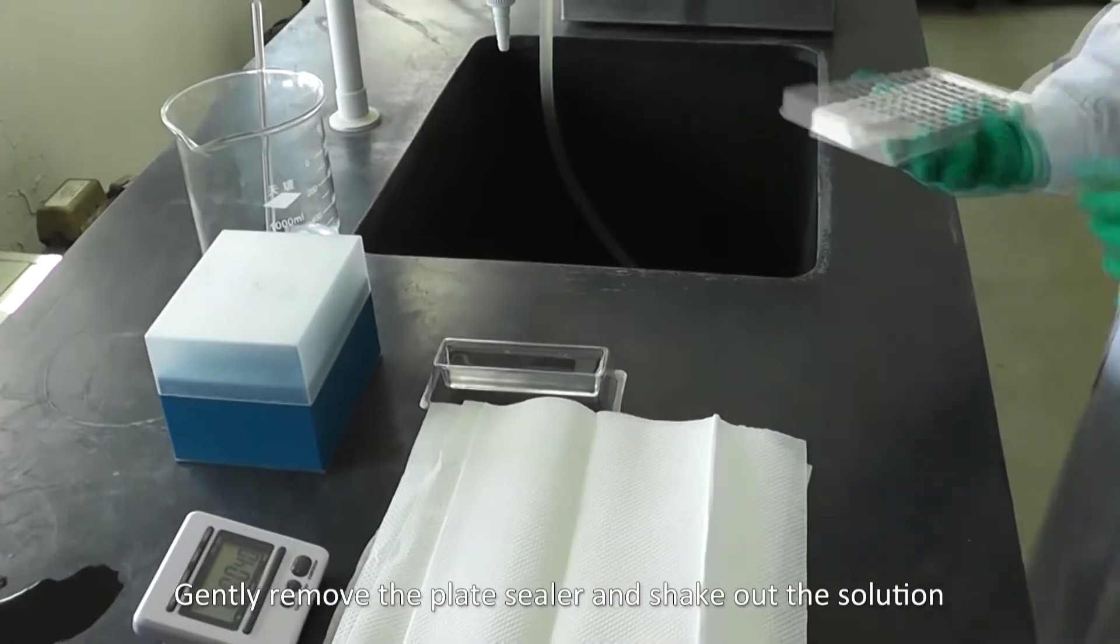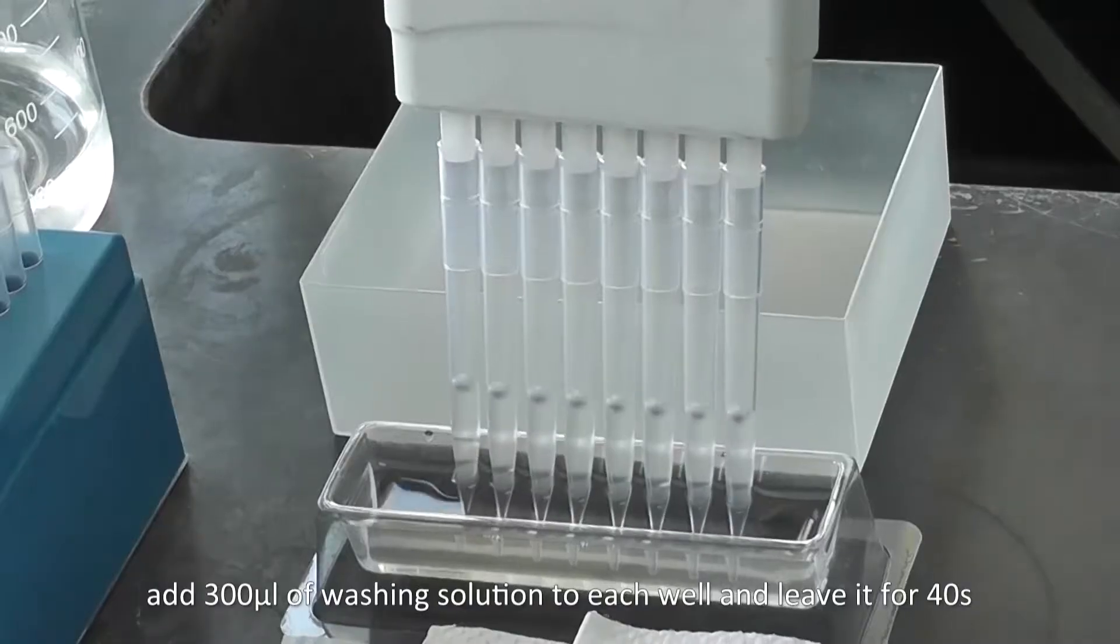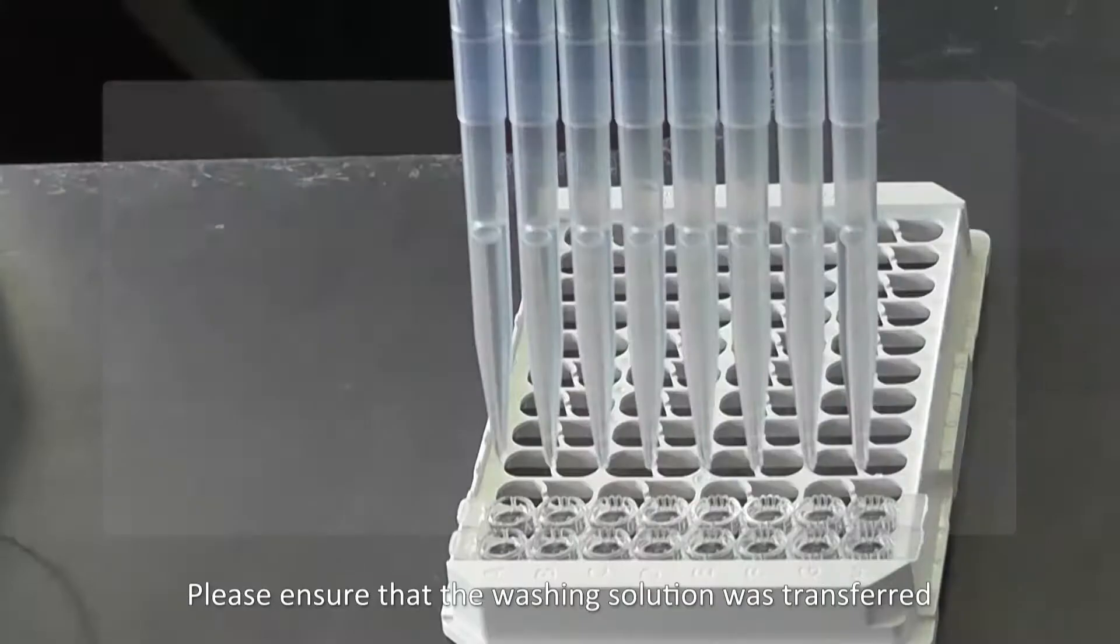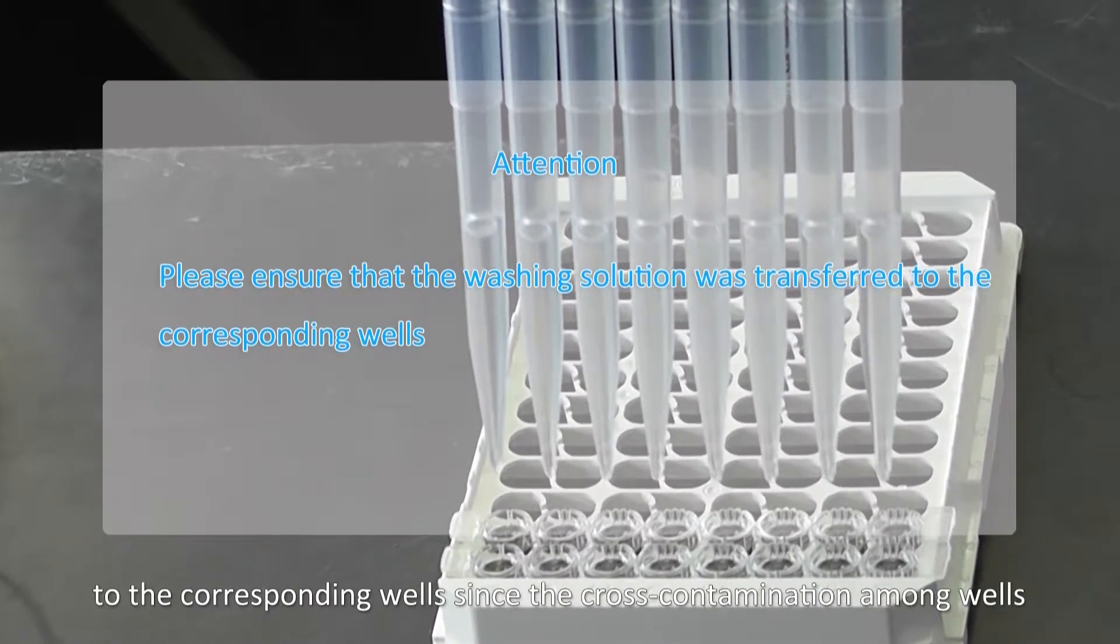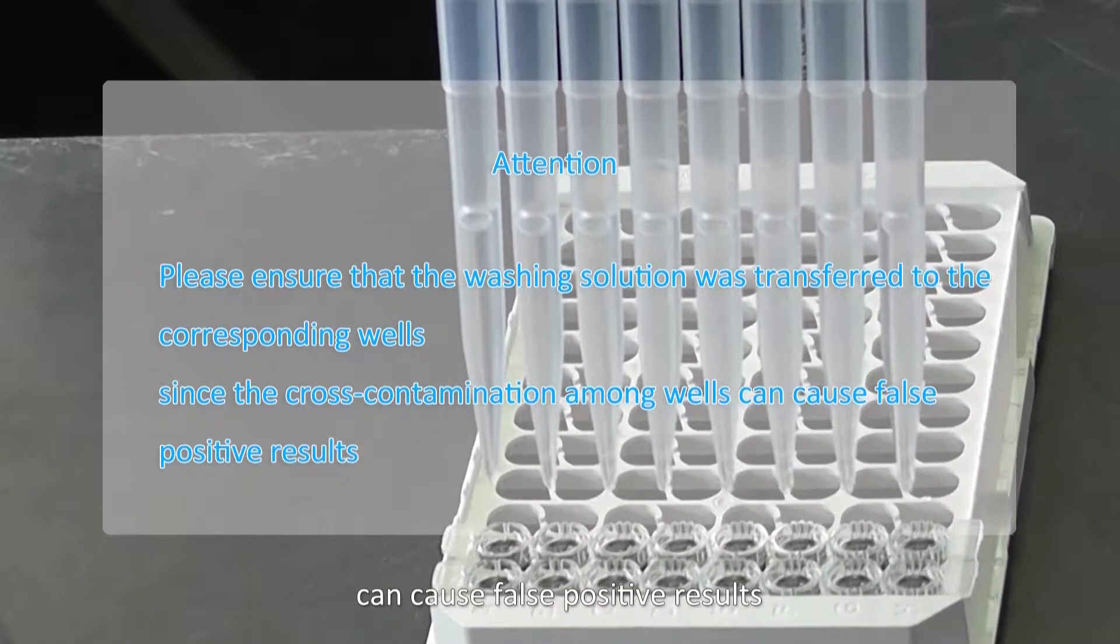Gently remove the plate sealer and shake out the solution. Add 300 microliters of washing solution to each well and leave it for 40 seconds. Please ensure that the washing solution was transferred to the corresponding wells, since cross-contamination among wells can cause false positive results.